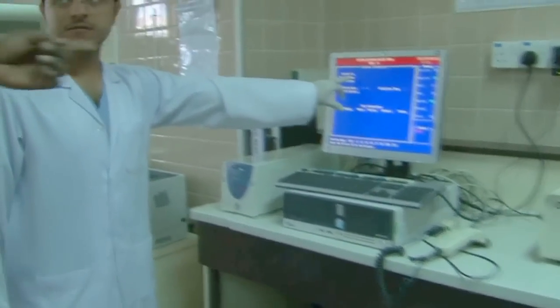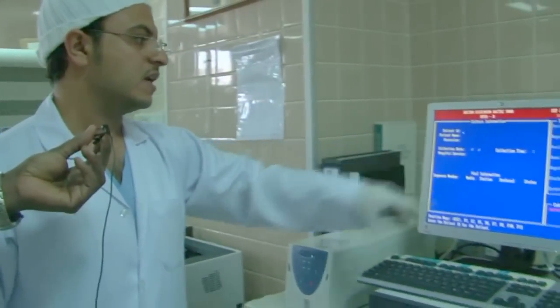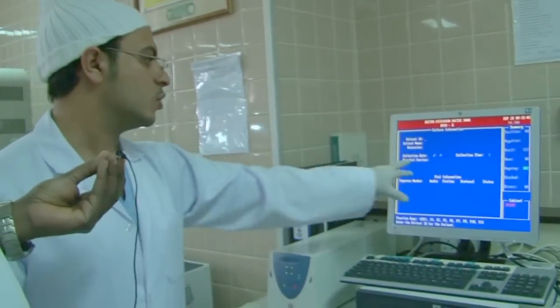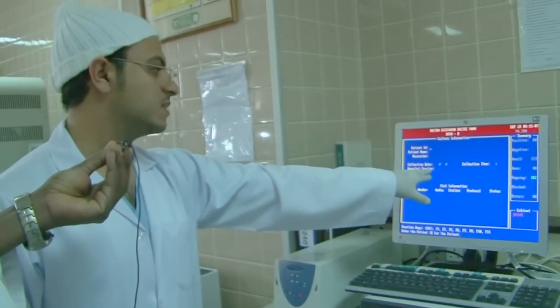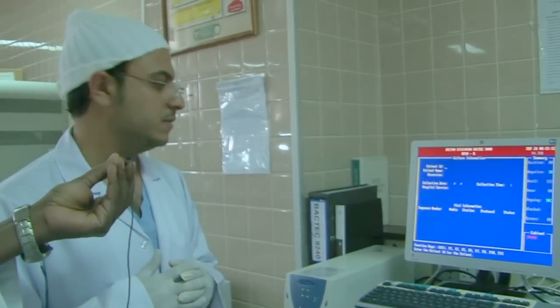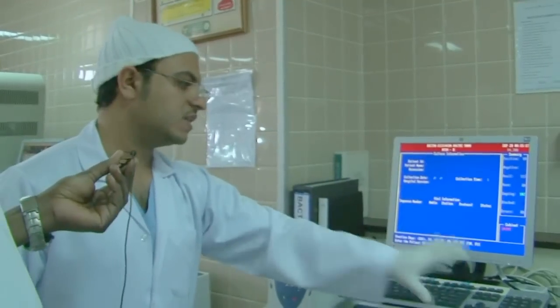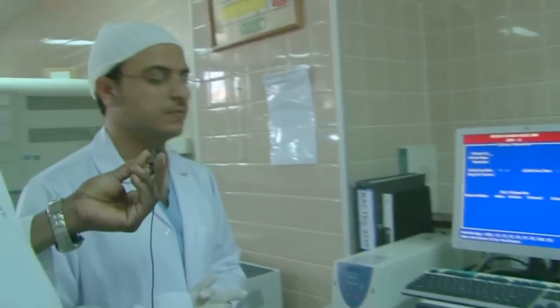And then the reading will be here, and it comes to the reader and software. Patient name, labelling in the lab, the collection date and time directly present, and the hospital service department. Then you put it in the instrument. After how long will you read it? 48 hours or 72 hours? 72 hours, maybe.